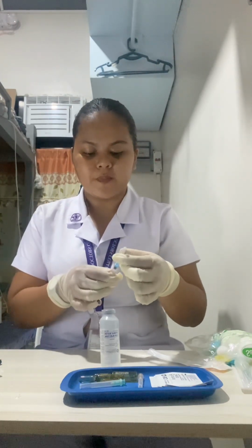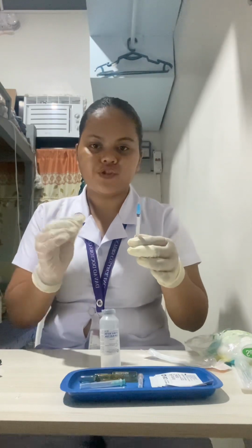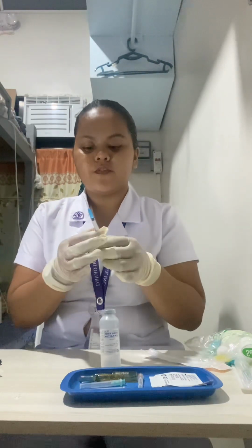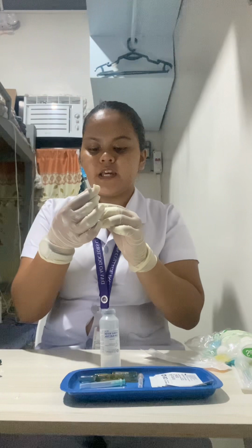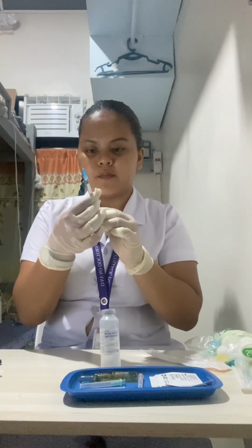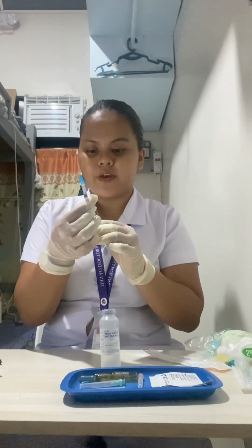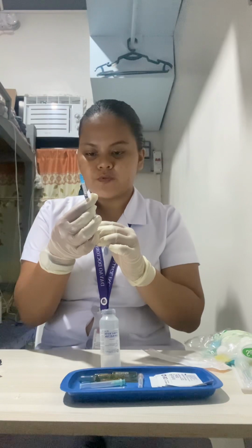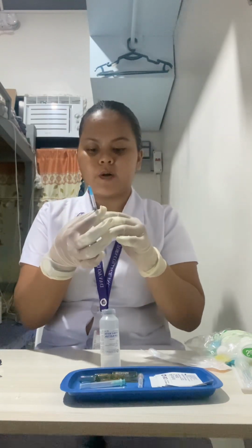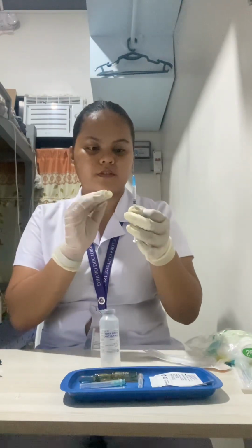After making sure that the filter needle is well attached, I'm now going to remove the cover, and this is when we are going to inject air equal to the volume of medication to be withdrawn. In the prescription, it is said that 0.5 ml is to be given. So I'm going to draw 0.5 ml of air into the syringe.